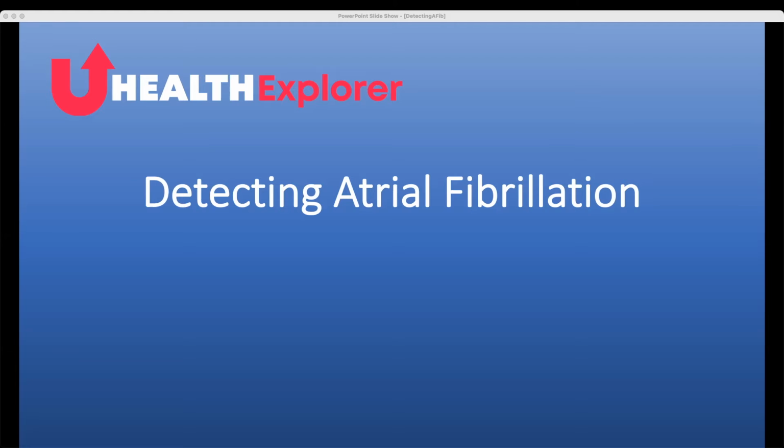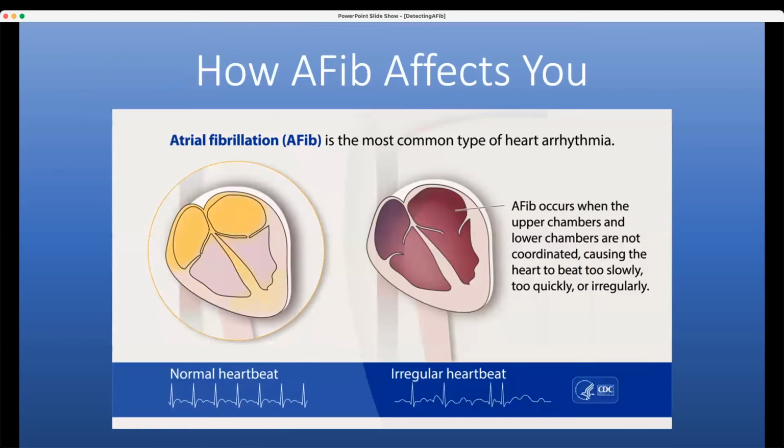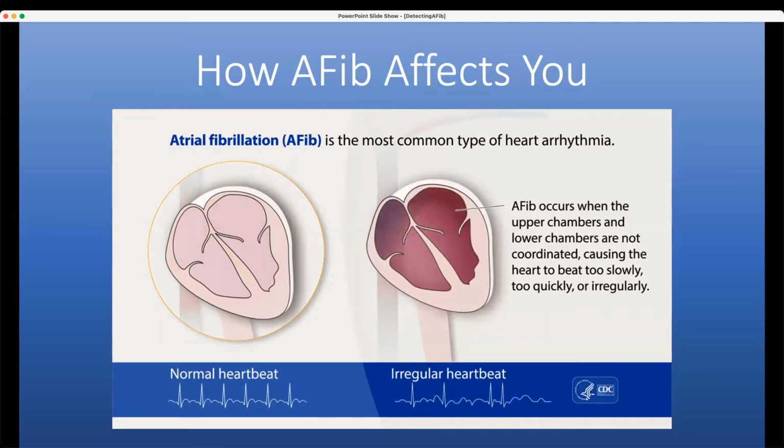you start experiencing symptoms. During AFib, several things happen to your body. Your heart rate increases, your stress levels increase, and your heart rate becomes irregular. Since the Health Explorer performs a statistical analysis of your biometric signals, you can easily see all these conditions graphically on the Explore Trends page.